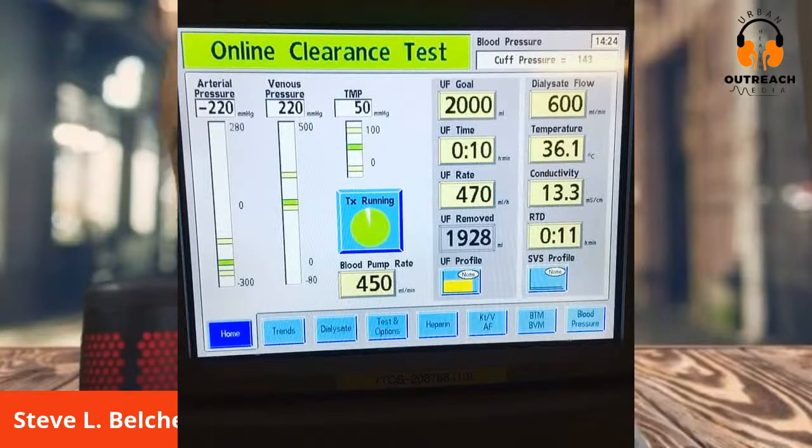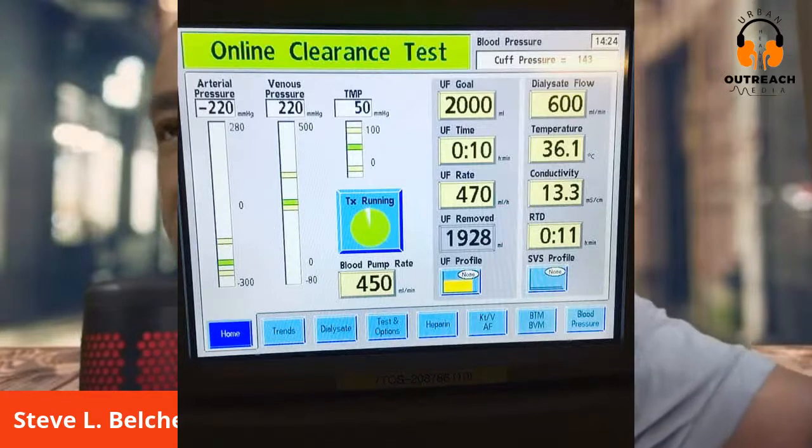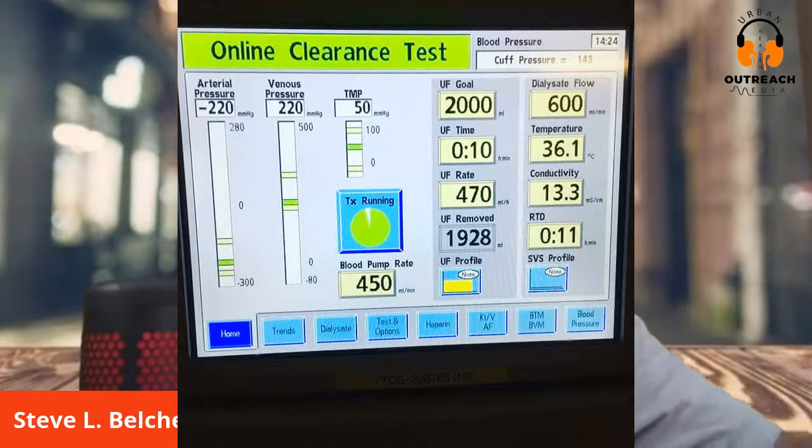Let me go back to the right for a minute. You see where it says 600 at the top? If you go up above that, your blood pressure is red. And let me tell you one other thing, for the warriors who may think about this in their dialysis center. You see at the top far right of this, what that 1424 is, that's the time on the machine. You know how a cell phone has a clock.